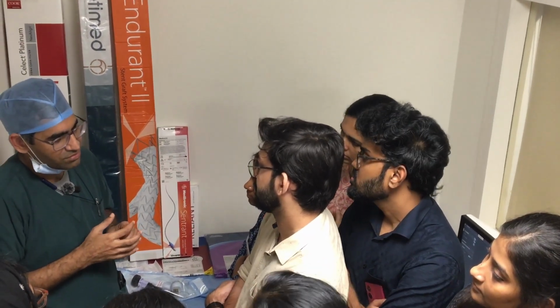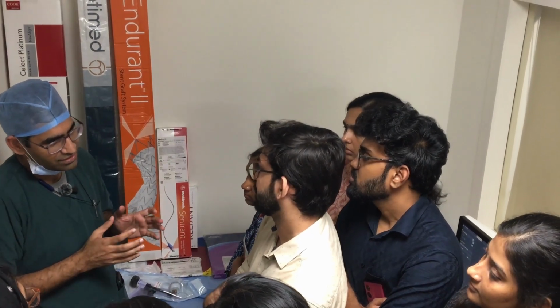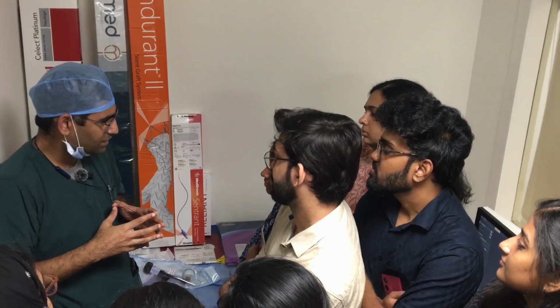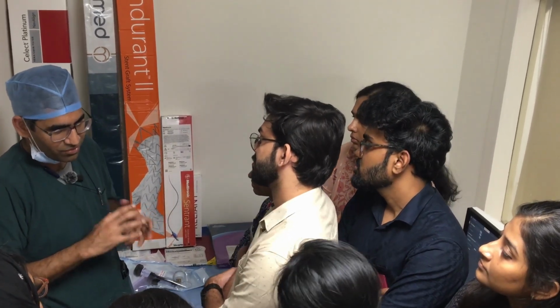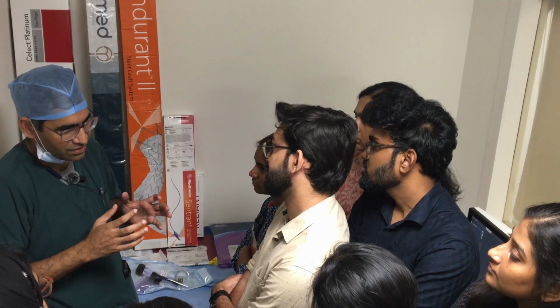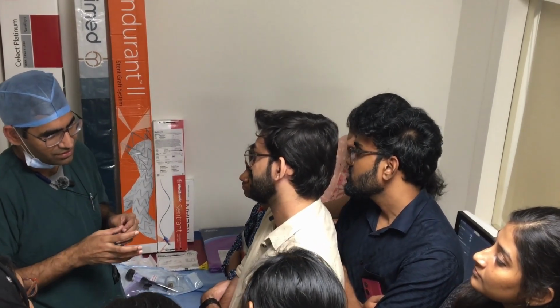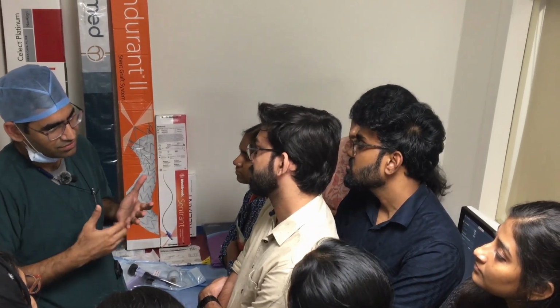It was developed by the NOL, Naval Ordnance Laboratory. So the name stuck, and it is called nitinol. The advantage of nitinol is it has a very good memory. Whatever you do, it will come back to the same shape. Disadvantage, it's poor visibility. You cannot see it under X-ray, so you have to add something to make it visible.